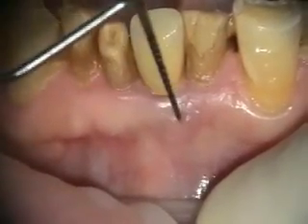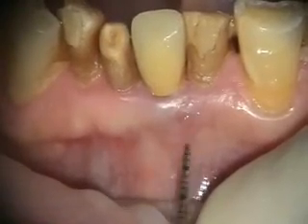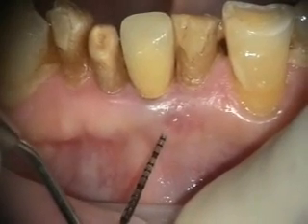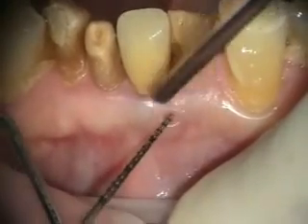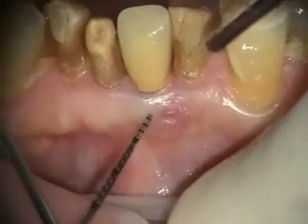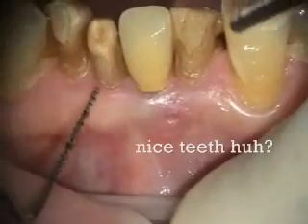Today we're doing a repair of this implant. About a week ago he came in and had this really large fistula and it was draining a little bit. We put him on a z-pack and it looks better, but there's still something going on underneath here. We got a probe in there, tracked right to the implant — didn't go apically, didn't go to either of the teeth.